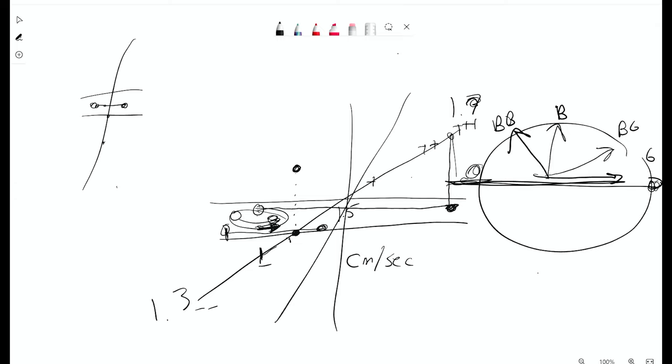Is there an option just to do this to avoid contrast to begin with? Yeah. So there's a couple of techniques. Typically, they're all based off the SSFP sequence. The SSFP sequence is the only sequence, no matter where it is in the body, that's going to result in bright fluid. And so Siemens calls it true FISP. GE calls it, like I said, Fiesta.